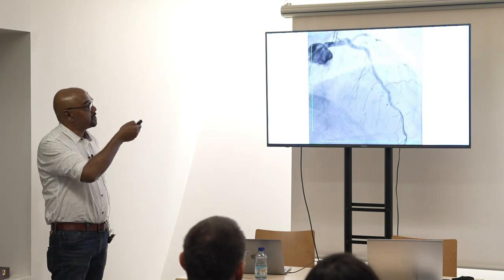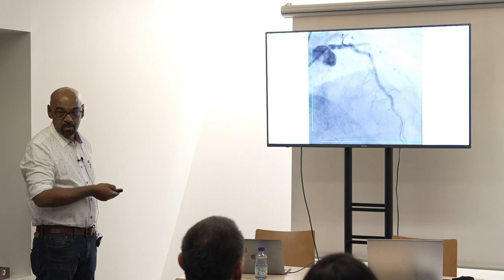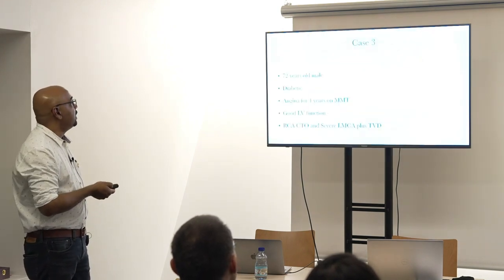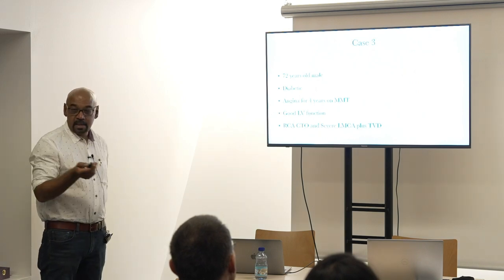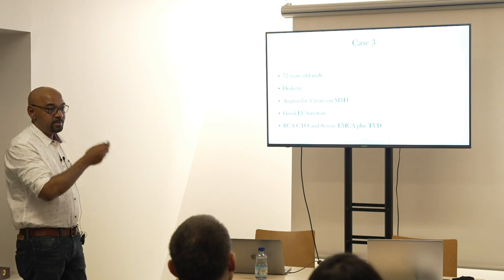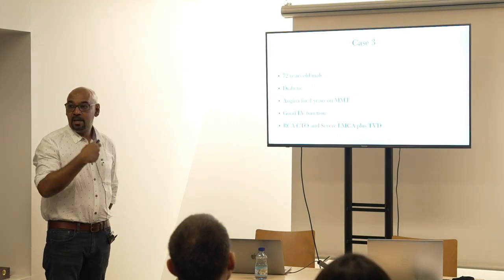This patient, actually, first we did the left main to LAD. Next day he had his surgery for this humerus fracture. Then the third day we went back and did his RCA. Actually, I should have brought the RCA, because the RCA also was a very funny situation. It was almost a CTO. So we had crossed the CTO, nothing would cross.